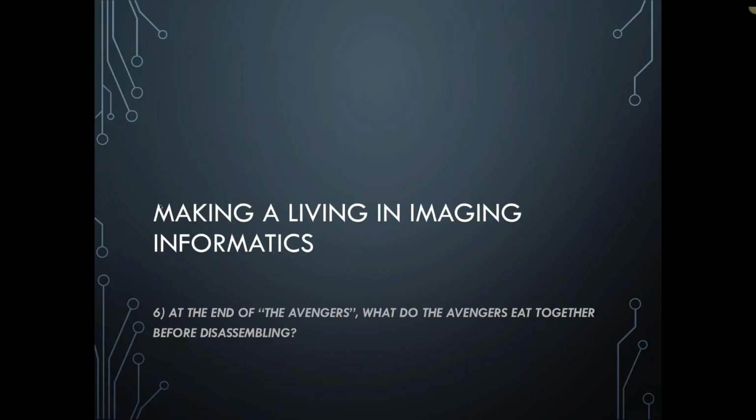Fantastic. And one other thing that occurred to me is, while you've really talked about the imaging informatics, increasingly, in addition to the imaging, are all kinds of associated data, other things like genetics or full genome sequencing, maybe proteomics or microbiome related data, for example, associated with each subject who's also undergone human neuroimaging or medical imaging. Does XNAT have the facility to incorporate that information, or is it linked in some way?